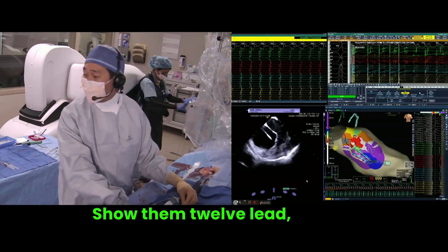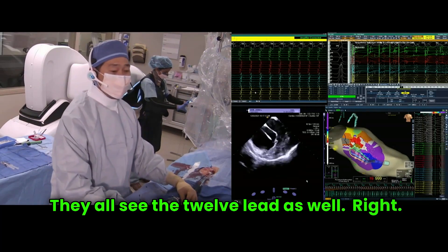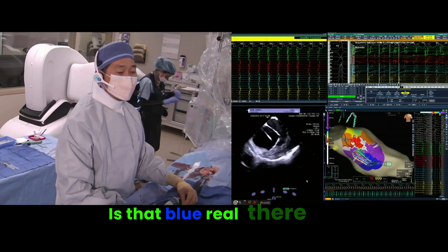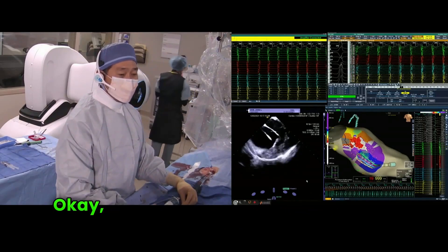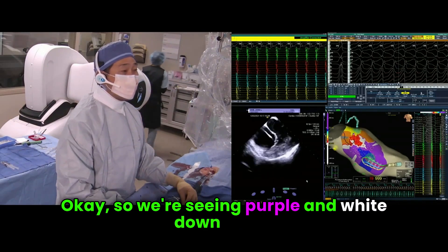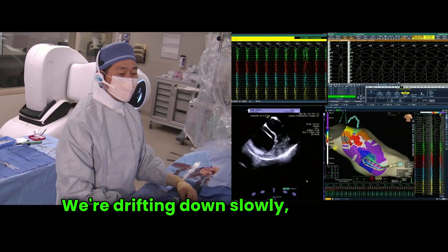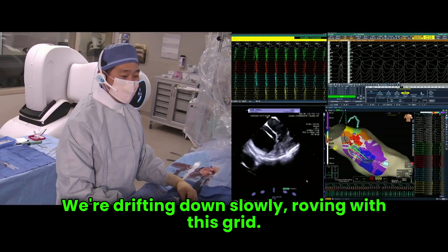Show them the 12-lead please — they all see the 12-lead as well. Is that blue real there? So we're seeing purple and white down there. We're drifting down slowly, roving with this grid.